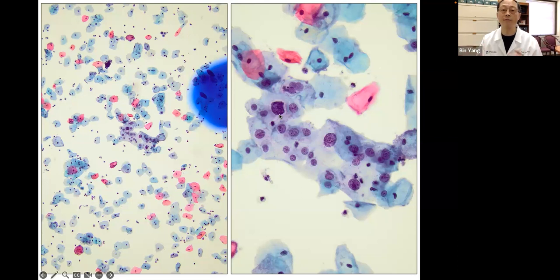You can see one feature is nuclear pleomorphism. If you think these are grandson, these are grandpa, you have 3 generations, which really tells you the size difference, very pleomorphic in LSIL. But they aggregate together, with low NC ratio.